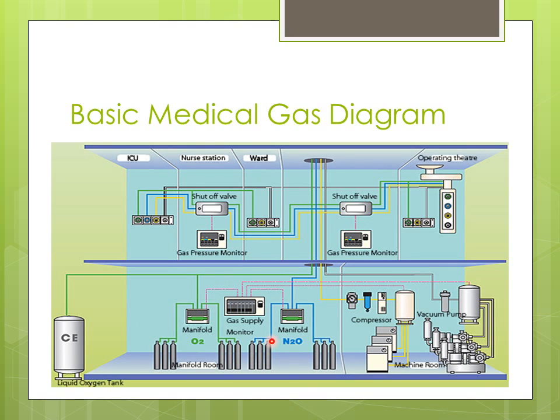However, there's some things about this room which is interesting. One is that this gas monitor needs to be protected. I'm not so sure that I would put a gas monitor in the room with all the oxygen tanks. If there's going to be a fire or something like that, this whole thing's going to be engulfed, and this thing isn't really going to work. So I probably would have put this in a separate room.